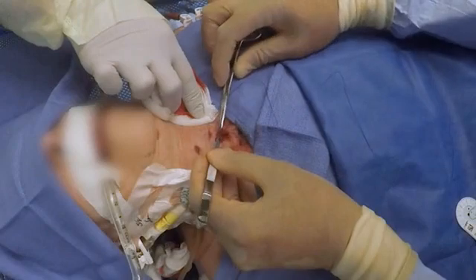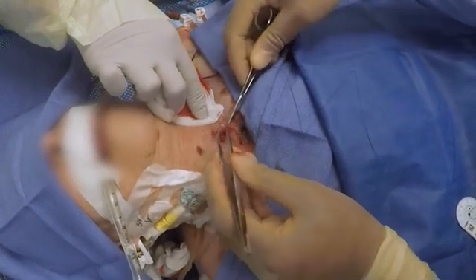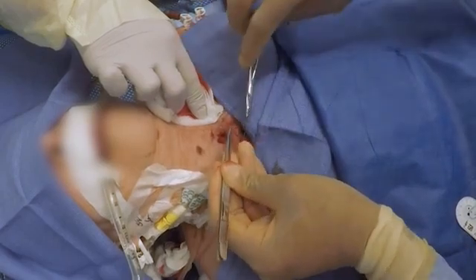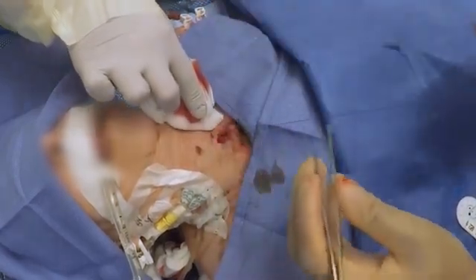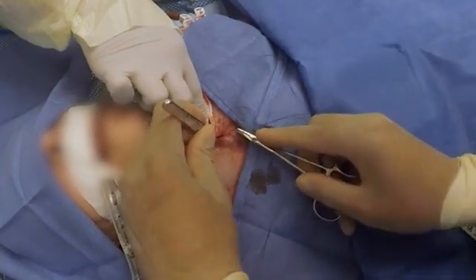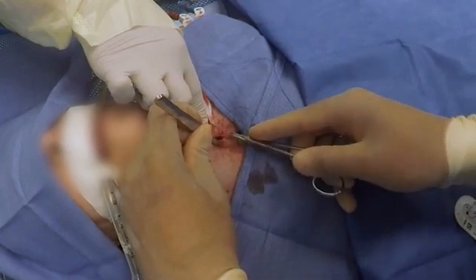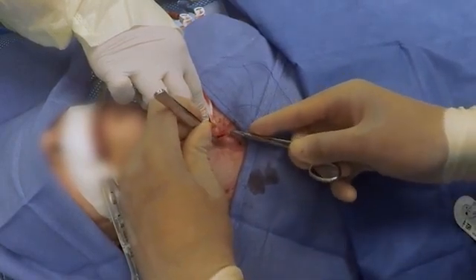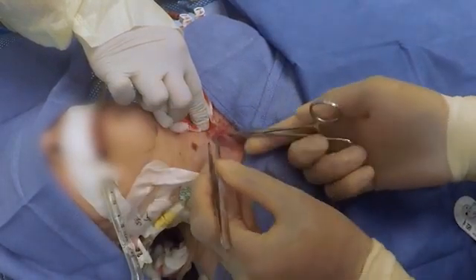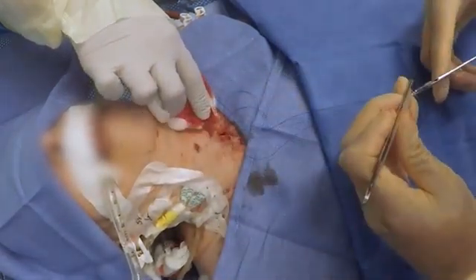In patients who require therapeutic anticoagulation, or in whom there is any risk of bleeding, it may be advisable to place a purse string suture around the tracheostomy incision with the use of a 2-0 Prolene suture. The purse string suture is placed but not tied during this step. It will be tied for additional hemostatic control once the tracheostomy tube has been inserted. The suture is generally removed on the second postoperative day if there is no evidence of bleeding.